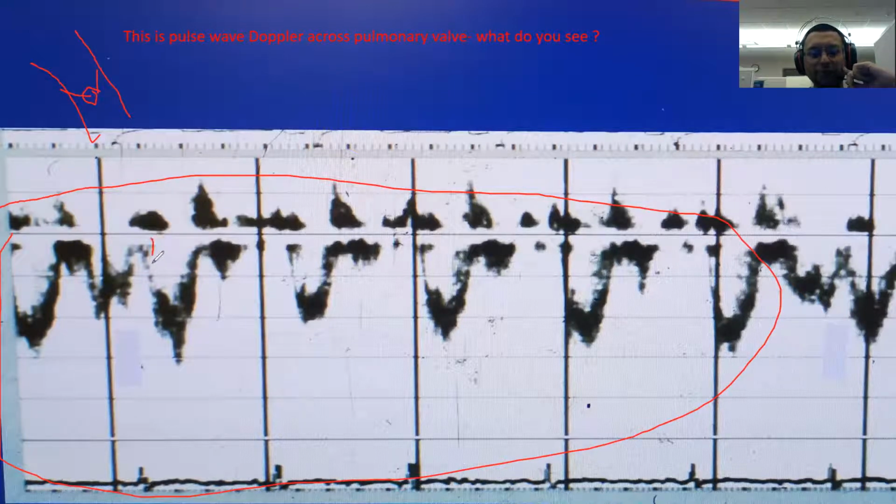So do you expect this? During systole there is a forward flow, right? So what abnormality do you see? Second forward flow. No, you also have a second forward flow, right? And this forward flow happens in what phase of the cardiac cycle? You have a second forward flow. So this is a normal forward flow. This happens during diastole. Sometimes it happens, but sometimes it doesn't. You have it here, and here, but in the middle it doesn't happen.